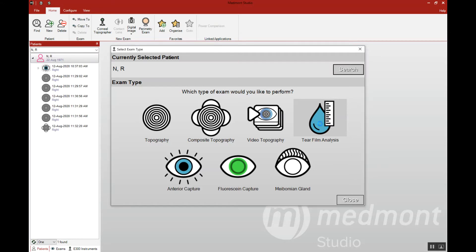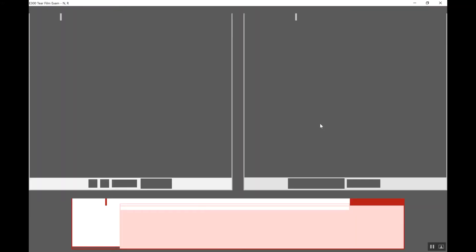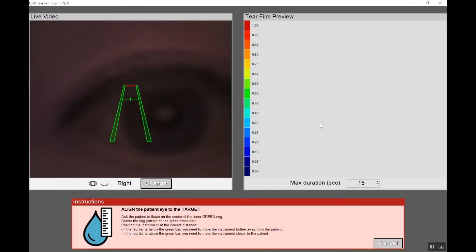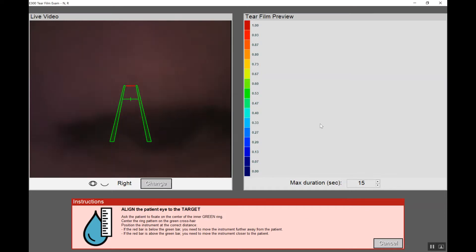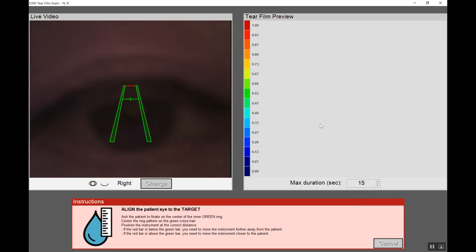When we select this test, it allows us to monitor not the shape of the eye but the fluid layer on top of the cornea, and look for that point where there's breakup — the percentage of the eye in breakup and the degree of breakup.